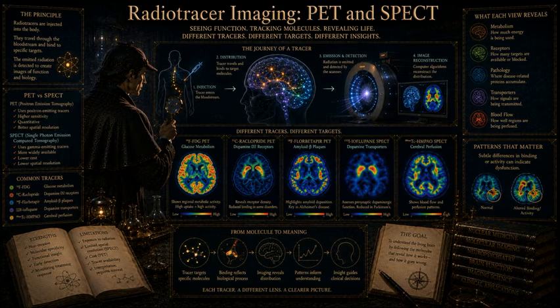All right. We have navigated the physics. We have established the safety parameters. We have our beautifully reconstructed, attenuation-corrected 3D tomographic image of the brain. The scanner has done its job. But a static picture of a glowing brain is not enough to answer complex psychiatric questions. We need to transition from making pictures to extracting biological meaning. How do we interpret the changing brightness of that image over a 2-hour scan to actually measure something real, like receptor density? Here's where it gets really interesting.